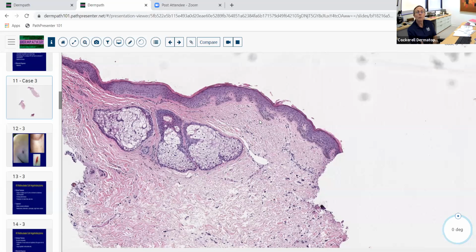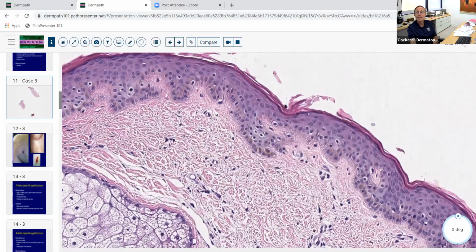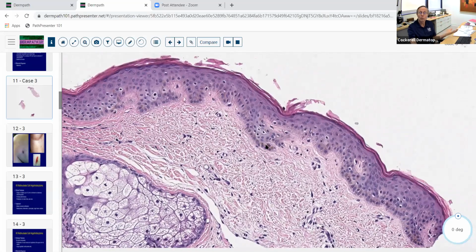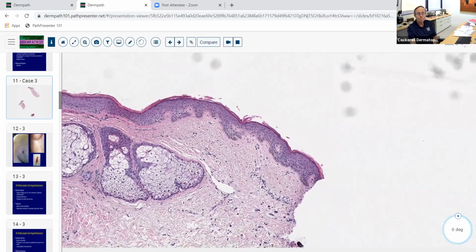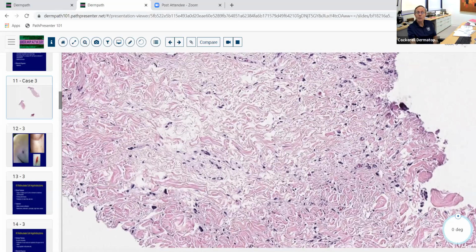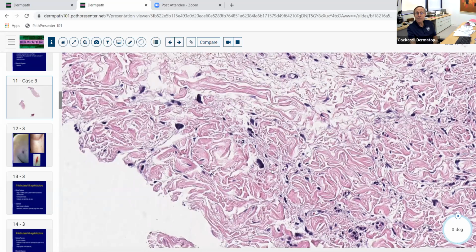So look and see, well, is there anything in the epidermis? Maybe it's tinea versicolor. Well, we'll look here real fast. No, there's nothing. Does it look like maybe there's a little bit of a macular type keratosis, a little budding? Maybe, depending on what the clinical is here. Could it be one of the reticulated epidermal pigmentary disorders like CARP or something like that? Maybe, but that's all just with no information. So let's look down at the dermis. And there's something going on down here that's a little different. There are these large cells that are hyperchromatic. That's not normal. So maybe it's a neoplastic process.